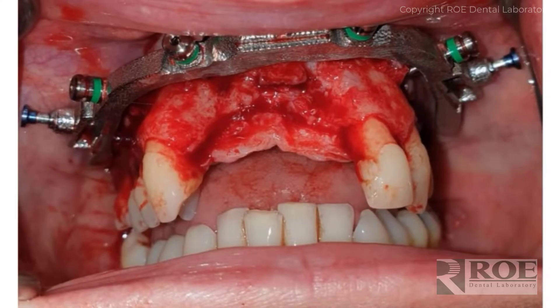In the maxilla you drill all the way transcortically, bury the drill, and the pin will stop about three millimeters shy — you simply tap it in with a surgical mallet and you are secure. You can see why the doctor chose FP1: this approach would have required a very aggressive surgery as FP3. One of the main things that separates Chrome from plastic guides is floating guide technology — notice this guide does not touch bone. The teeth-supported guide delivers the metal with no undercut and no fitting; it's all held by pin trajectory.